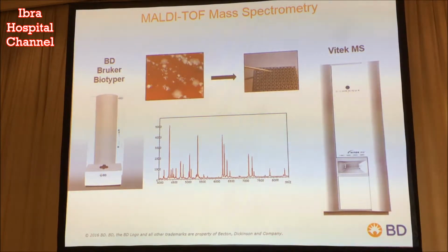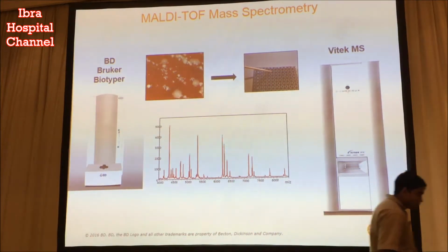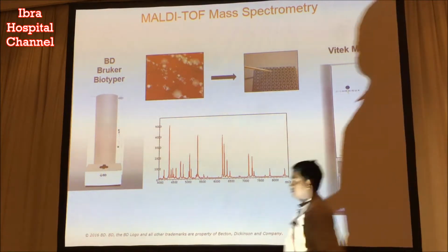And although it wasn't the first mass spec tool that I used, we eventually migrated to using MALDI-TOF. And this was now about 16 years ago when we were doing this work. After 4 or 5 years, I became convinced that the technology was reproducible.